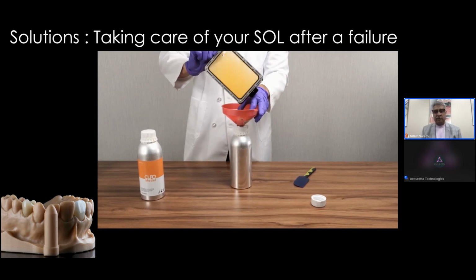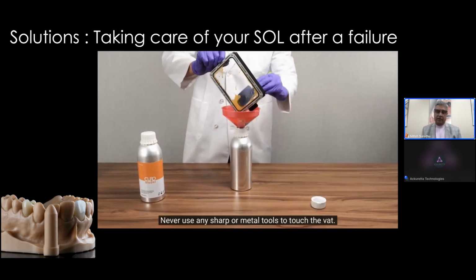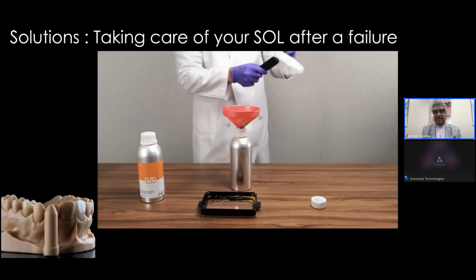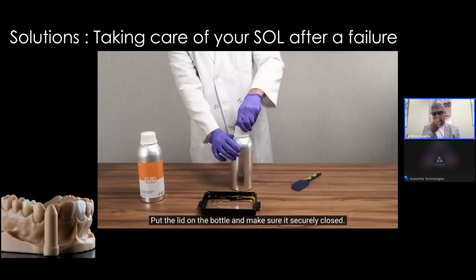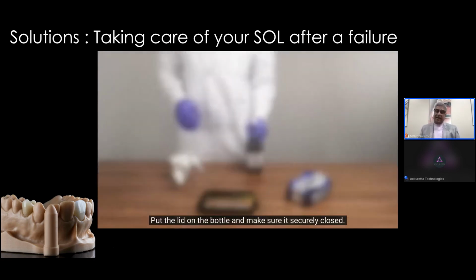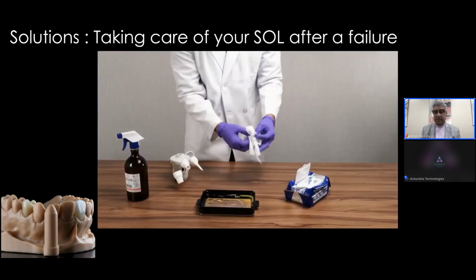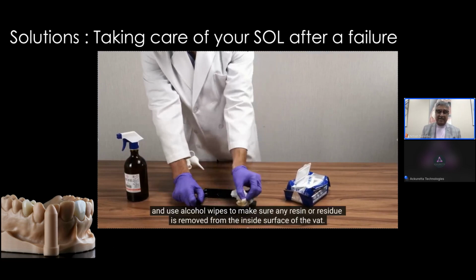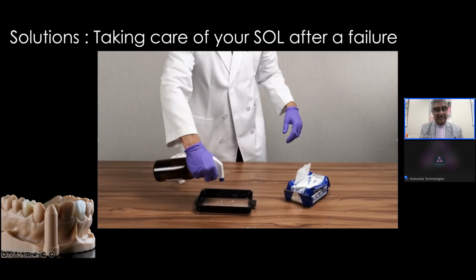After you've poured all the resin, make sure you use something soft like a silicone spatula to take off excess resin from the bottom of the vat, from the film. Then make sure you close your bottle. Of course, you don't want light exposure for your resin; you don't want to partially cure it. You can put that away, and then using a spray, you can spray IPA onto the film and use wipes and tissues to clean away excess resin. Make sure you get every nook and cranny that the resin can be hiding in. We won't go into that in great detail, but you get the idea.